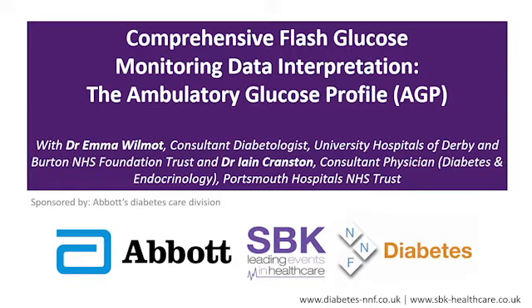Whereas if my sugars are at 5 and I know that at that time of day I'm usually falling, then clearly it's a time I will need to be more careful. So I think the AGP effectively allows us to see all of the important factors around glucose and glucose flux that we would need in order to give sensible advice around therapy adjustment.